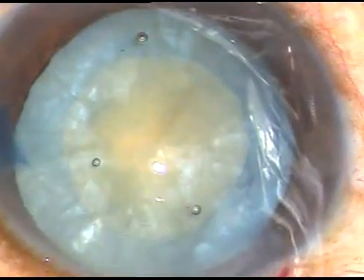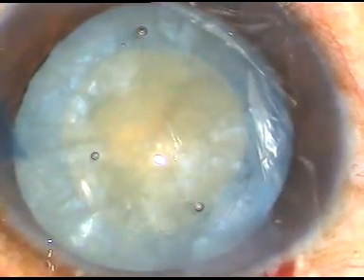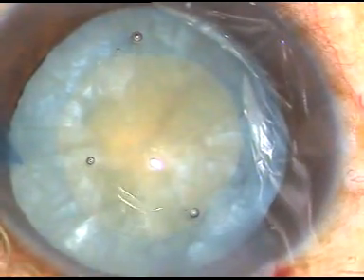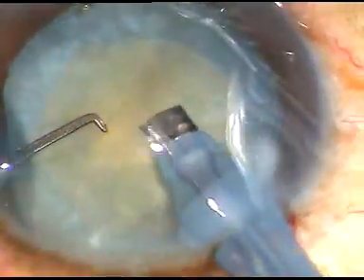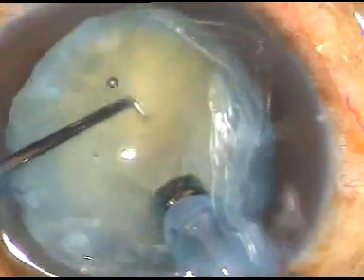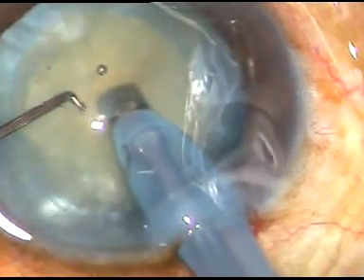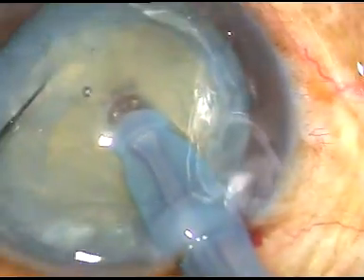Now viscoelastic substance is injected again. This cataract, although intumescent, although it is mature, it is not hard. It is maybe grade 3. We can very well do direct chop in such cataracts. Here it is. Embed the phaco tip into the lens matter and chop it.